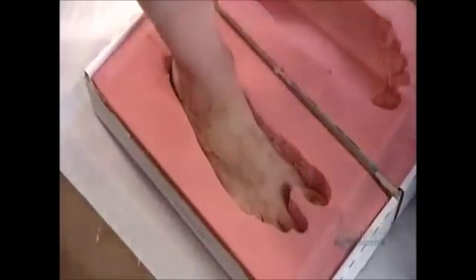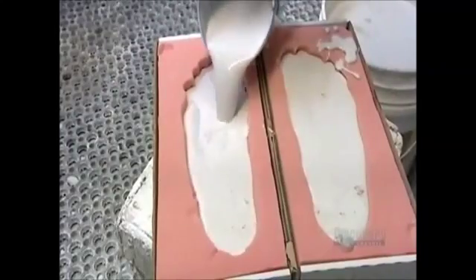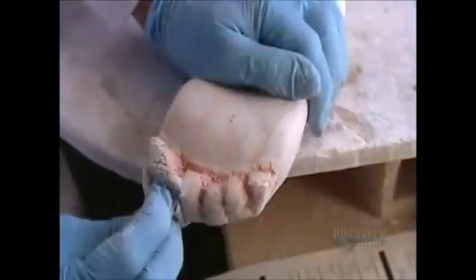Next, a 3D impression in foam. It goes to the production department where technicians fill it with plaster. Once it dries, they extract an exact model of both feet. Now they can construct the orthosis piece by piece.